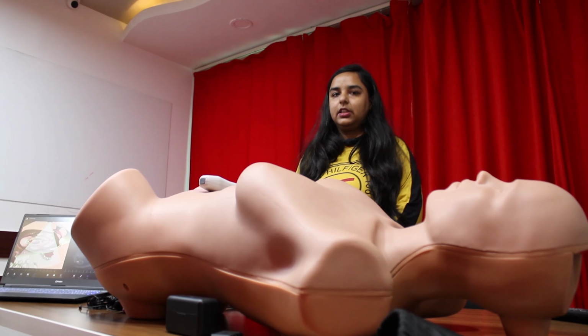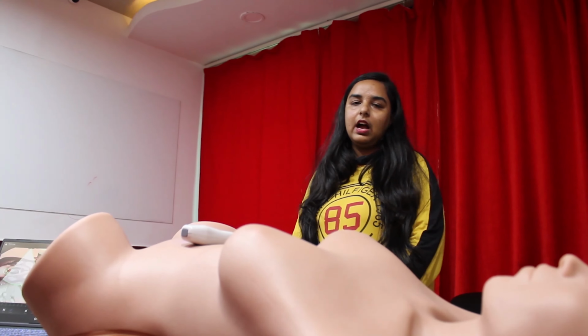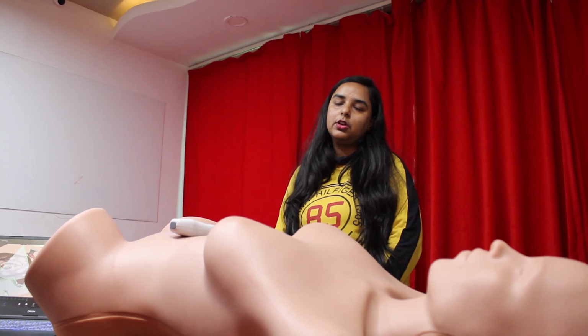This is a US-based technology which is specially designed for learning purposes. In this, you will have more than 1400 pathologies which you can change as per your requirement.